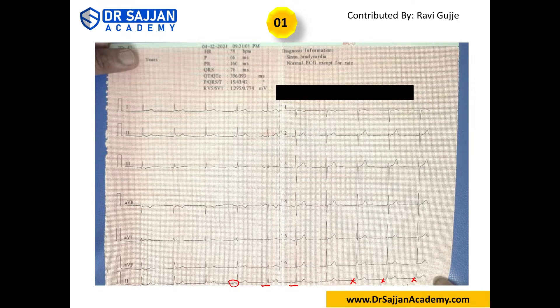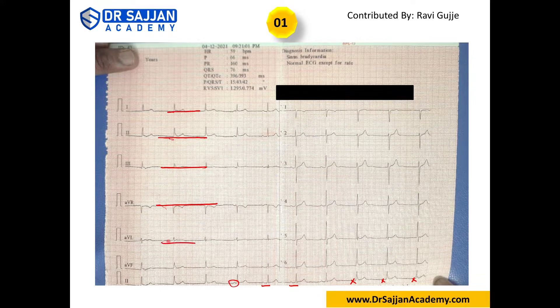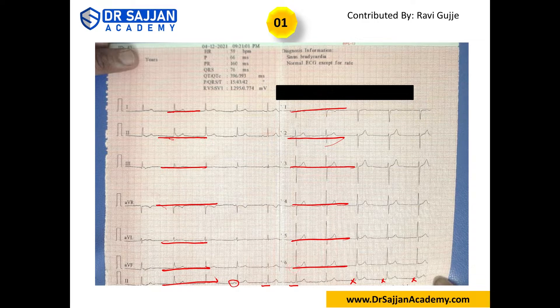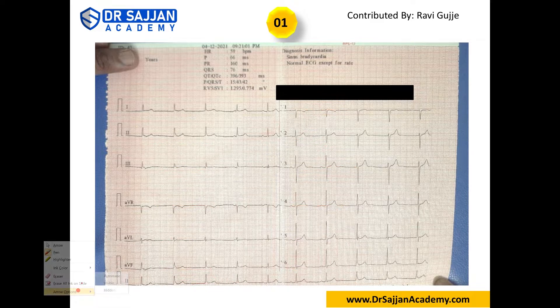The PR interval is normal. Now the ST segment: if you draw a line along the isoelectric baseline, you can see that everything stays within the isolated line — there is no change in height. This shows there are no changes in the ST segment.